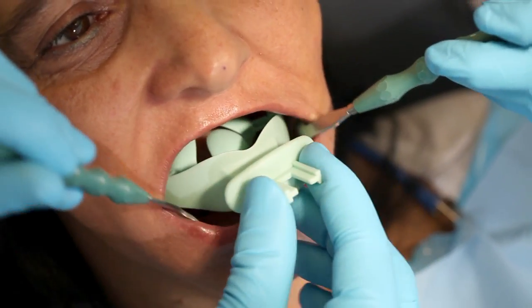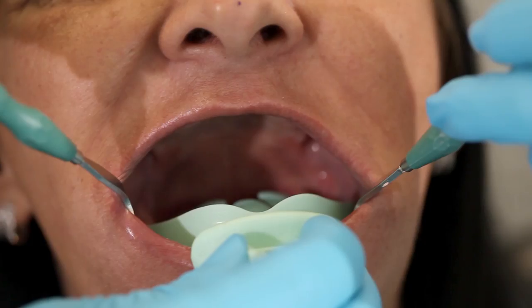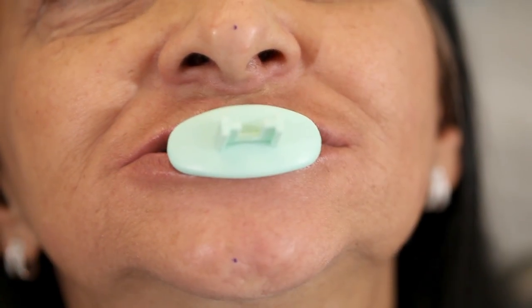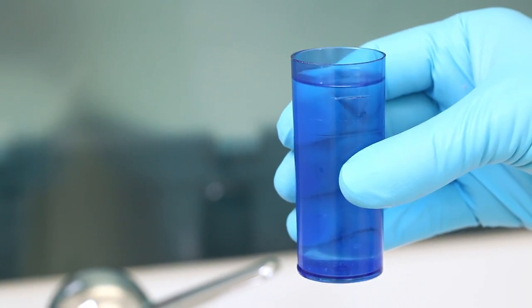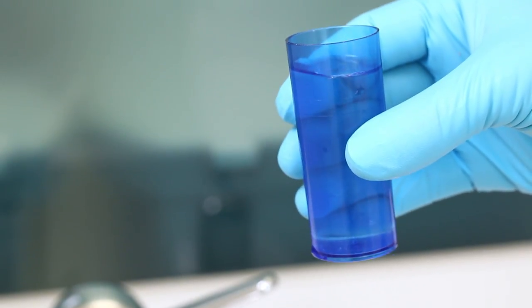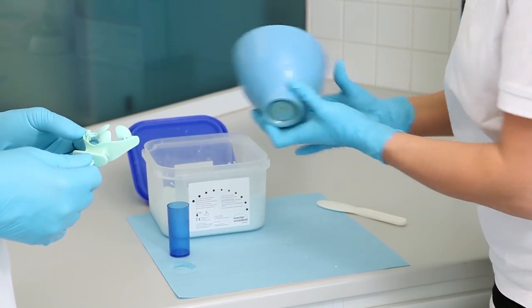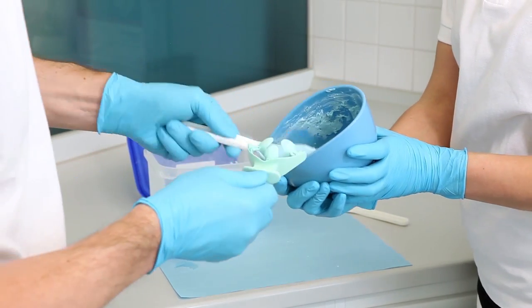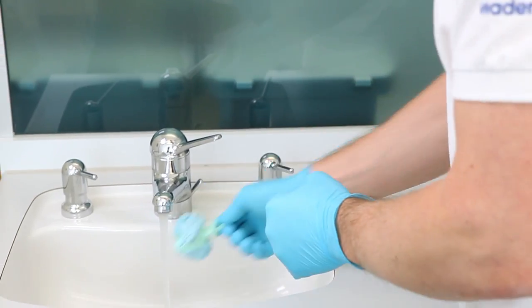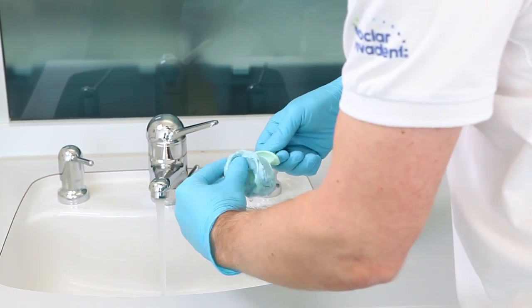Try the centric tray in the patient's mouth to check the available space. If alginate is your preferred impression material for this step, its consistency should be quite thick, achieved by mixing the powder with less water than specified by the manufacturer. Alternatively, silicone putty can be used. Apply the impression material to the centric tray, giving it a slightly convex shape in the upper jaw. In the lower jaw, create a shallow rim and shape it with the help of some cold water.